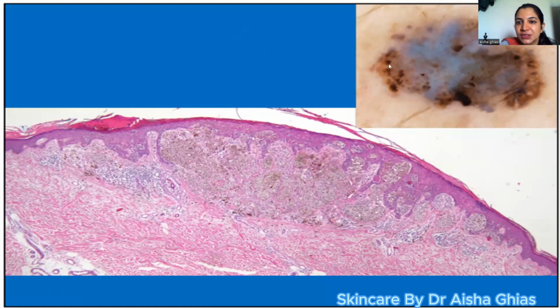you may see these eccentric dots. These dots are in the periphery. They are not in the center. They are not even distributed throughout the periphery. So they are significant. What do they denote? The color is brown, which means that the activity is junctional. It's not deep in the dermis. It's junctional. Now let's see it in the histopathology slide.